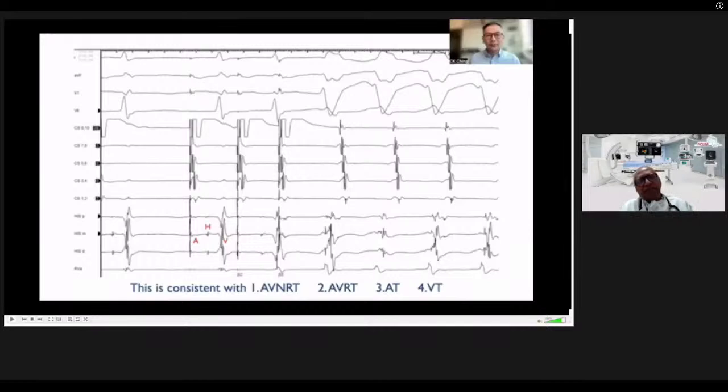Balbir said, the reversal of activation, you can see his polarity has suddenly changed. You look at the tracing where Dr. Ching has marked AHV, in the bottommost panel. AHV is negative in the first two beats, and then it becomes positive in the third beat. So the activation wavefront between anode and cathode has reversed, and that is very typical of an atrioventricular pathway.